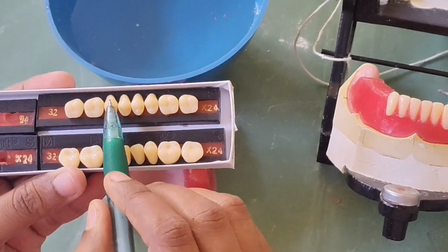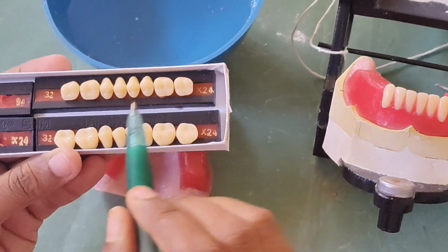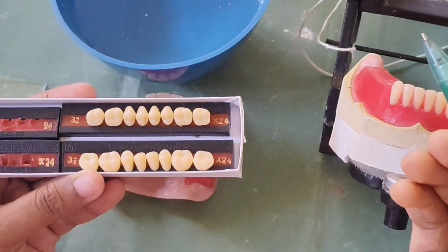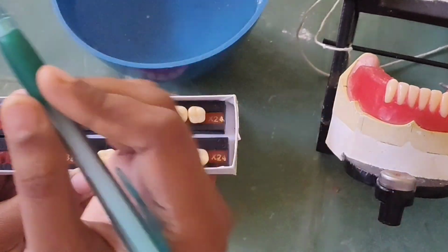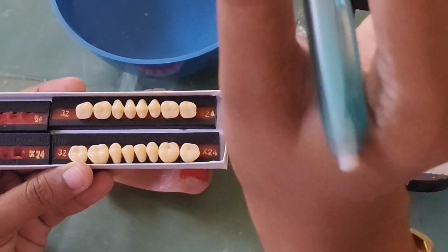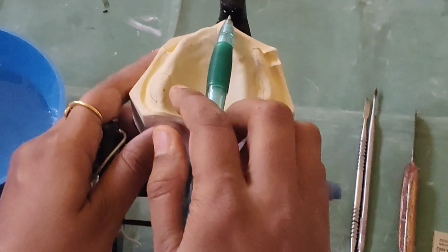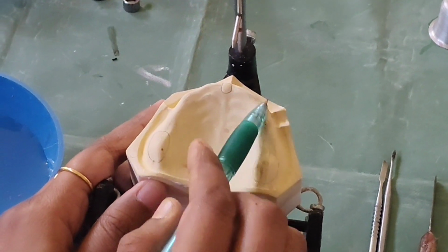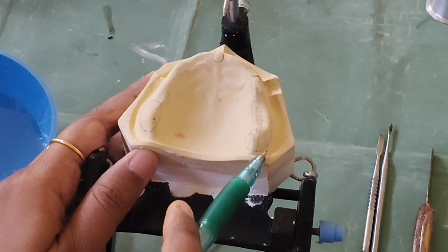Also, apart from that, mesial and distal, you have to be careful which side you are using, because the first time maybe it is arranged like this, but again and again when you are using it, you might get confused with right and left. So make sure when this is the midline, whenever you are arranging the teeth, the side which is towards the midline is mesial. Away from the midline, the other side is distal.